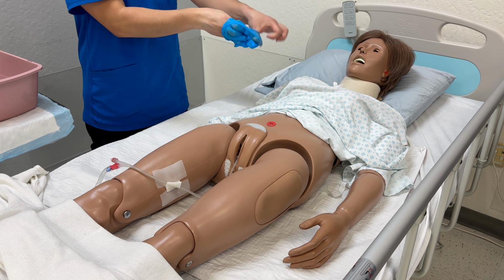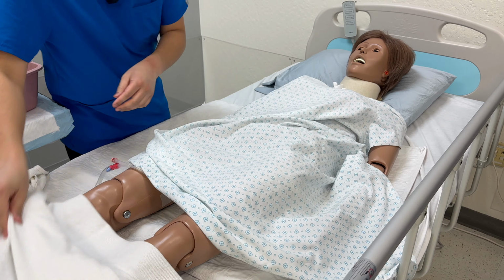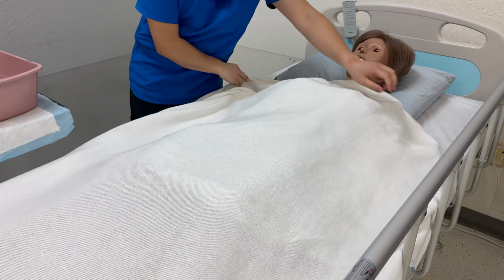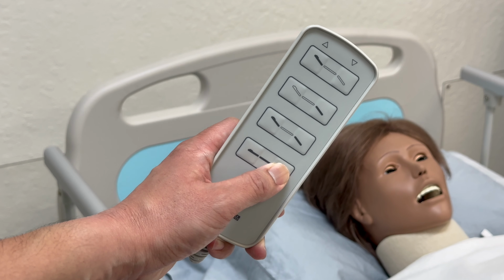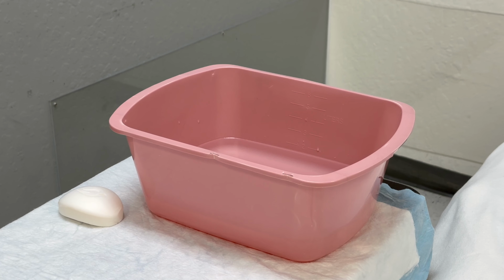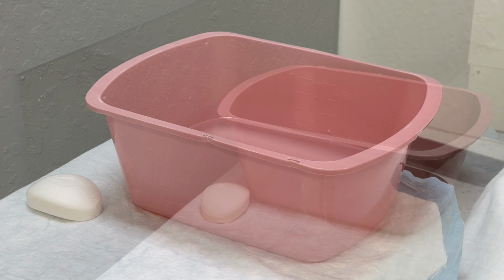Remove gloves. Sanitize. Raise the side rail. Lower the bed to the lowest position. Empty, rinse, and dry the basin, and place the basin in a designated dirty supply area.